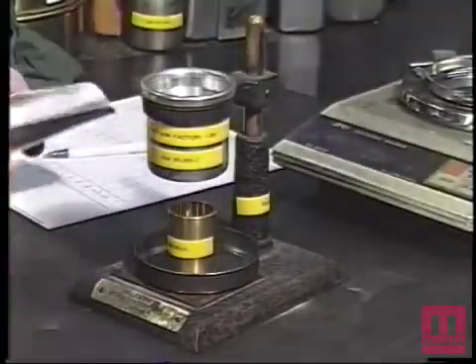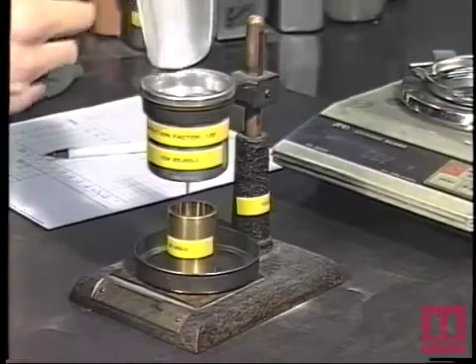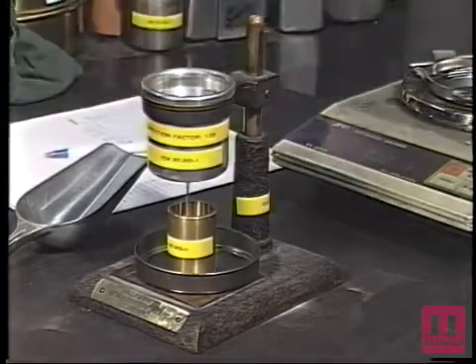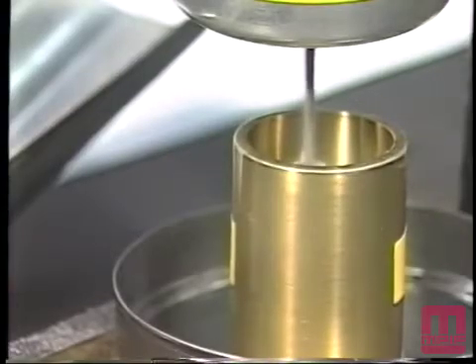The entire test specimen, consisting of a volume of approximately 30 to 40 cubic centimeters of powder obtained in accordance with MPIF Standard 01, shall be carefully loaded into the flow meter funnel and permitted to flow through the discharge orifice into the center of the density cup. The testing apparatus should not be moved during the filling.